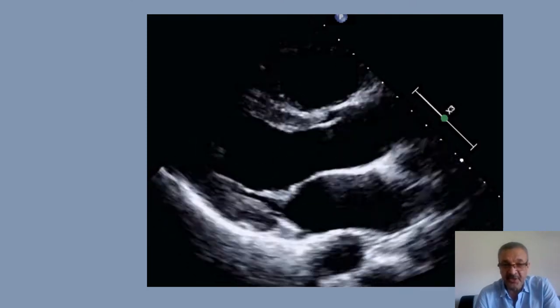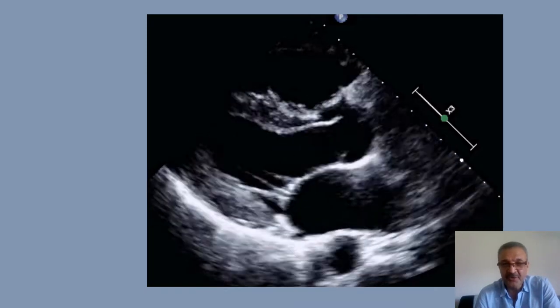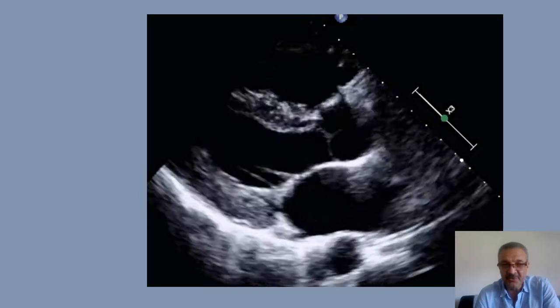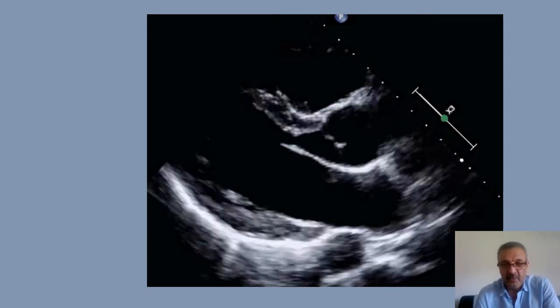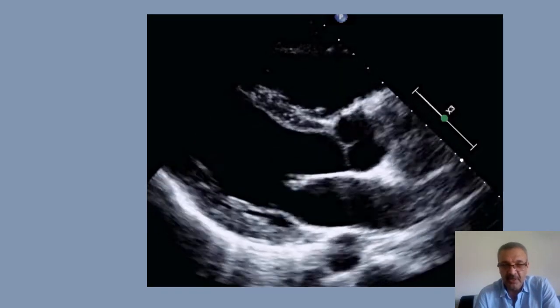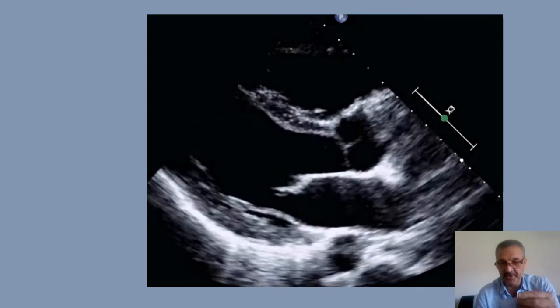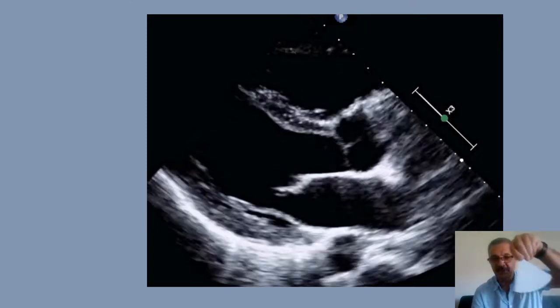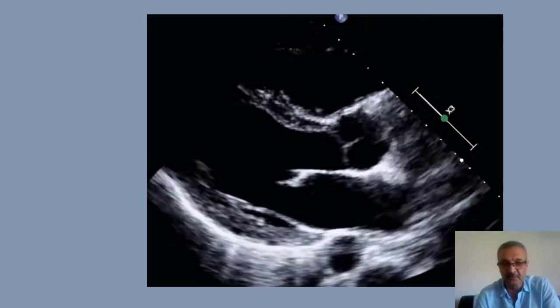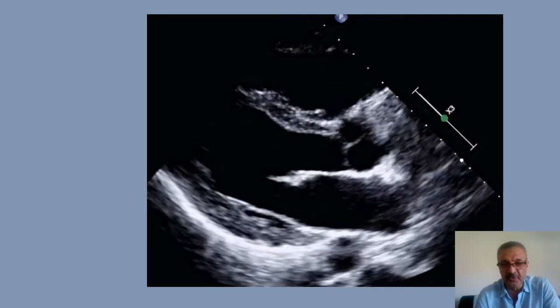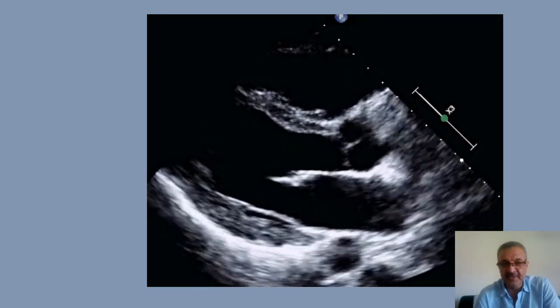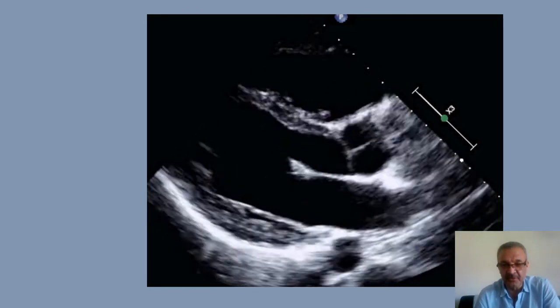Second, the orientation direction of the septum and ascending aorta — usually the distance between these two should be equal, creating a balanced angle. With heel-toe rocking, you can make the septum more horizontal or more oblique. Based on this maneuver, you can fix the orientation of the heart on your monitor.